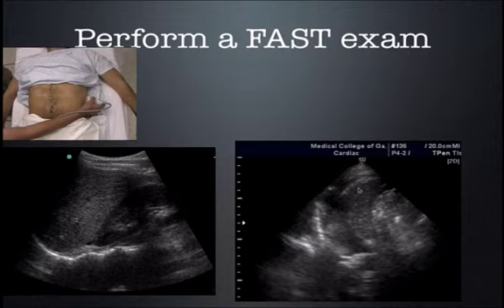Here's a positive finding. Here's the spleen. Here's the diaphragm. Here is free fluid between the diaphragm and the spleen. This would be a FAST positive case.